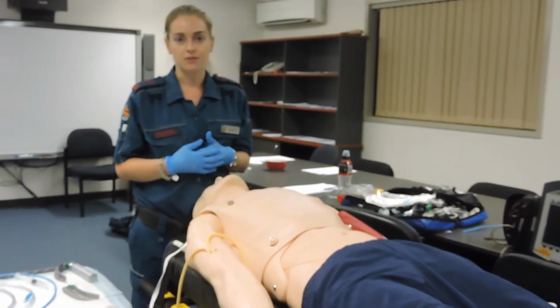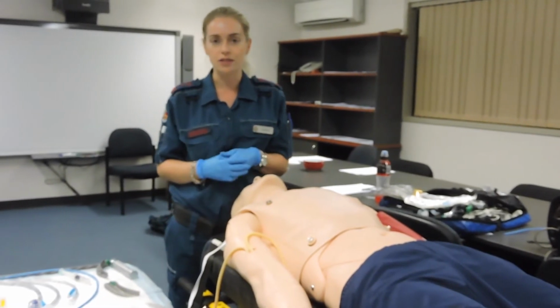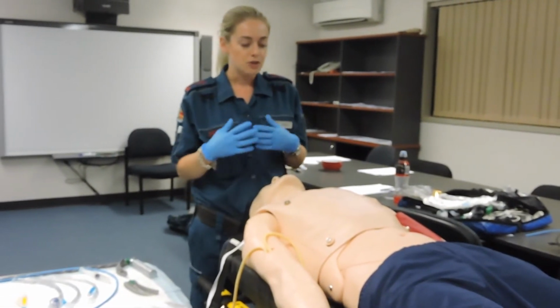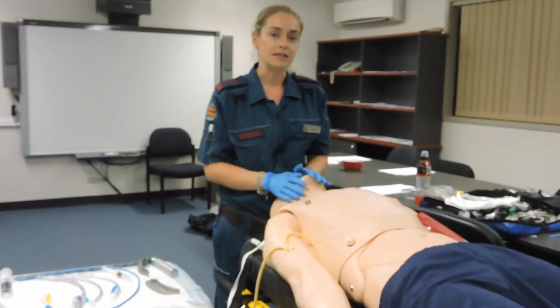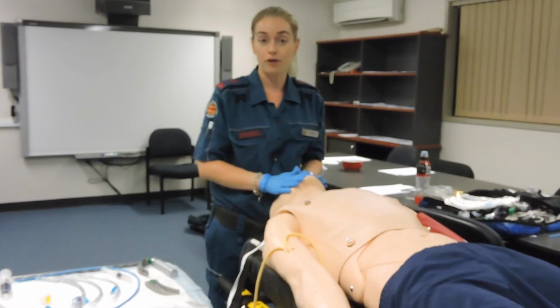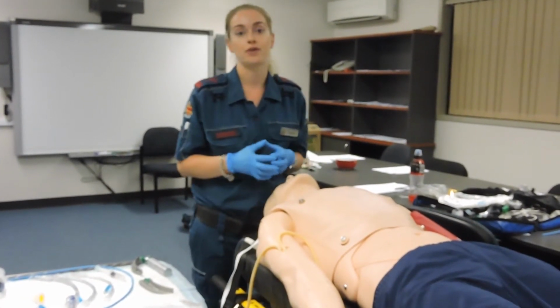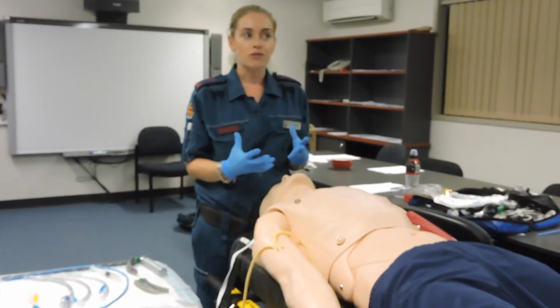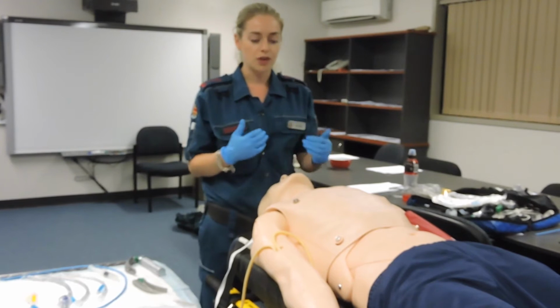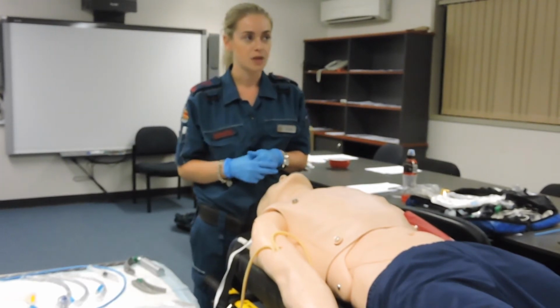Once the first attempt has failed, it's stipulated that the most senior clinician on scene with the most experience takes over. So in our situation where we've had an initial fail and we can't ventilate that patient, we attempt an oropharyngeal airway, bilateral nasopharyngeal airways, and a 2-person BVM ventilation technique. If that corrects it, then we reattempt, looking at optimising our patient position and laryngeal manipulation.